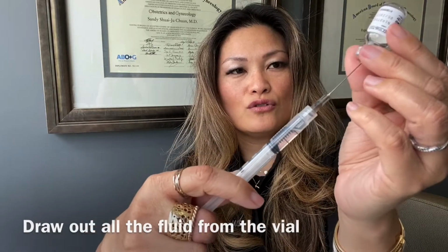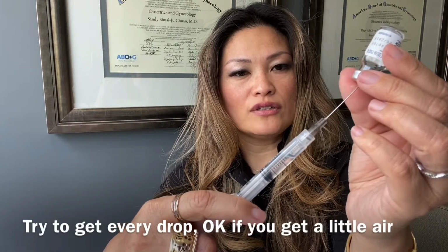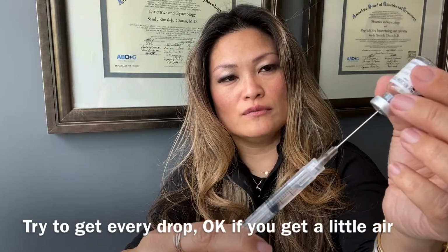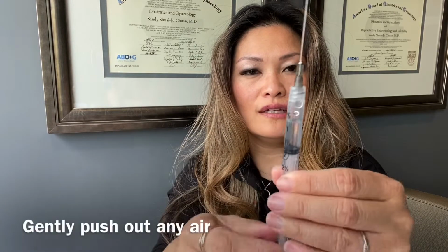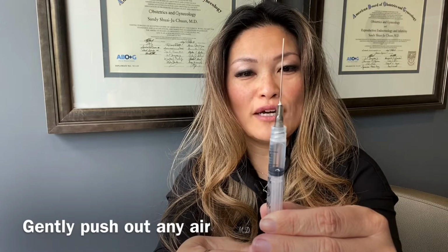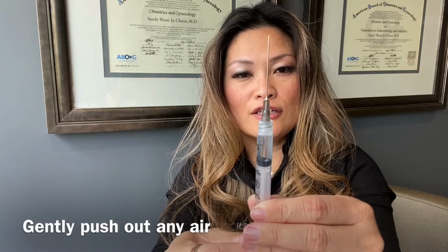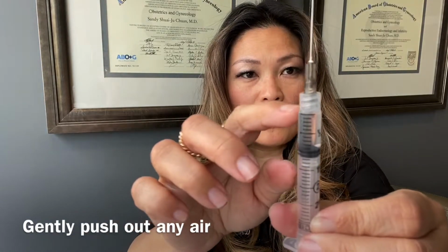With this, I usually end up getting a little bit of air because I want to make sure I get every little drop. And to get every little drop, sometimes you're going to get some air. So take that out. And remember I showed you there's a little bit of air. Then you can push the syringe gently. You don't want to shoot out all the medication and waste it because the medication is costly, so you want to be really careful with it. But you can push it all the way to the top so that it's all fluid, okay? Now, if this is all you need, then at that point you're done. And you would carefully put the cap back.